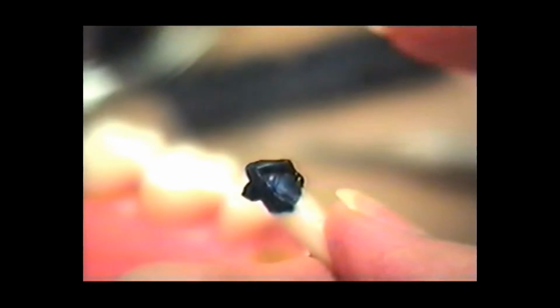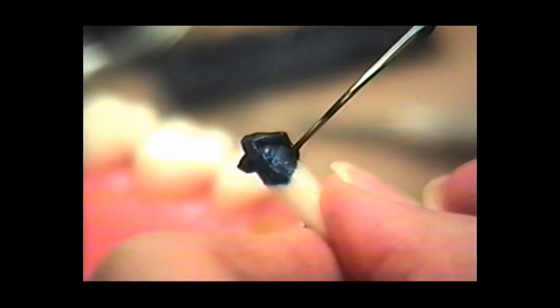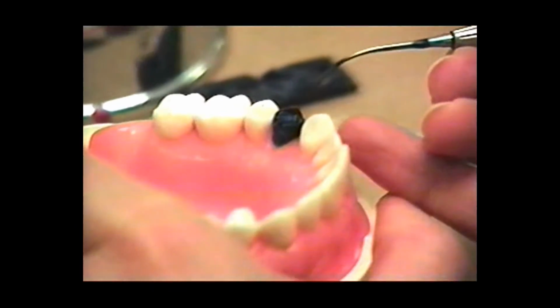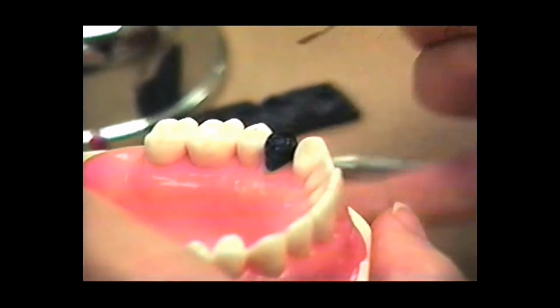And then all you have to do is fill in this area right here with wax. And then you come back and you do the same thing that I did at the distal toward the mesial. Get your mesial cusp arm developed.